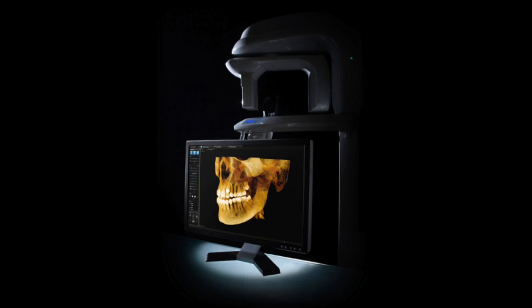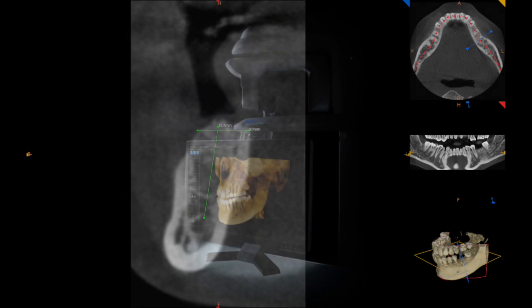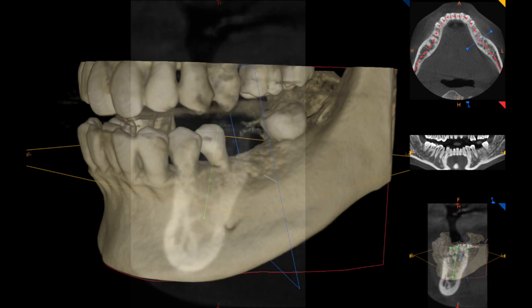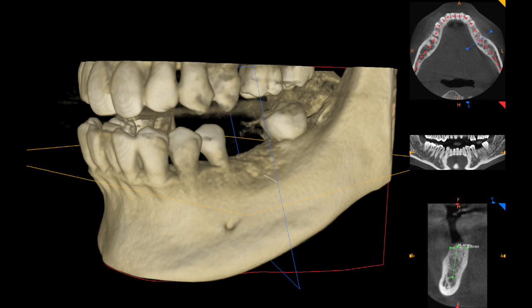Next, a cone beam CT scan is obtained, which precisely captures the anatomy of the bone and teeth, providing three-dimensional information on the bone and vital structures, such as nerves and sinuses.